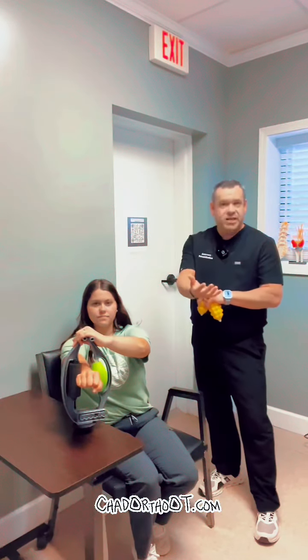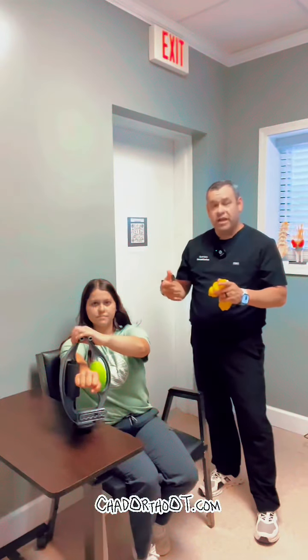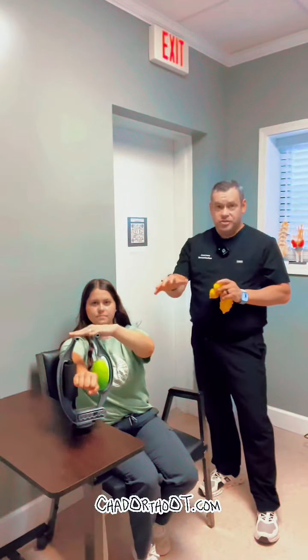Thank you to Rollflex for sending me this product to try and review. This is really cool whether you're having tennis elbow, carpal tunnel syndrome, just pain and soreness in the forearm and the arm or the legs — you can use this product.